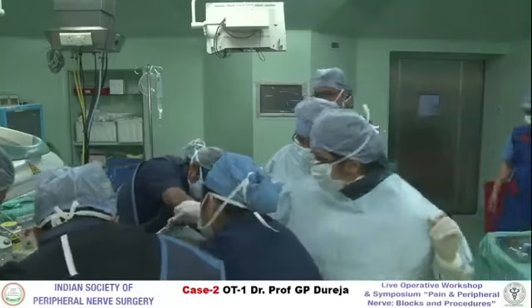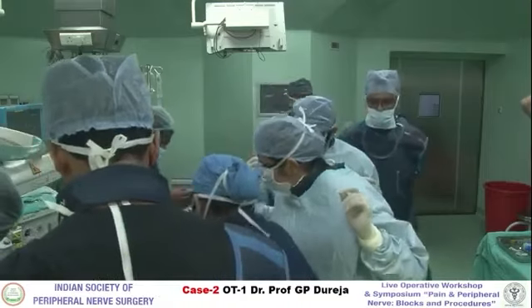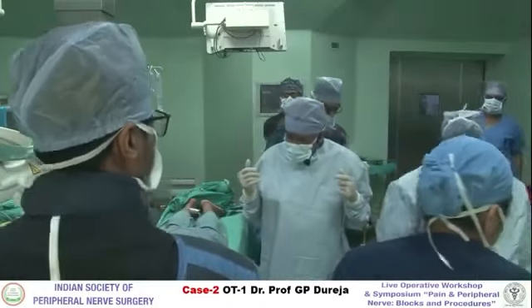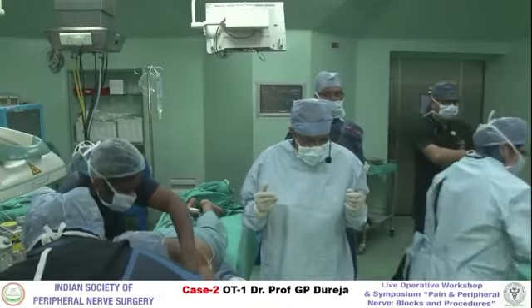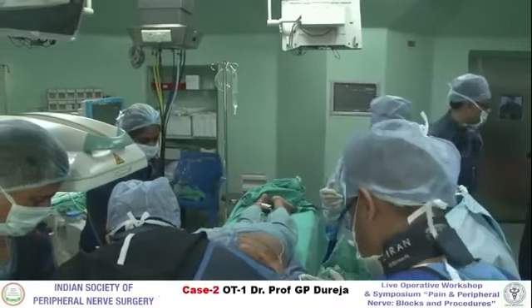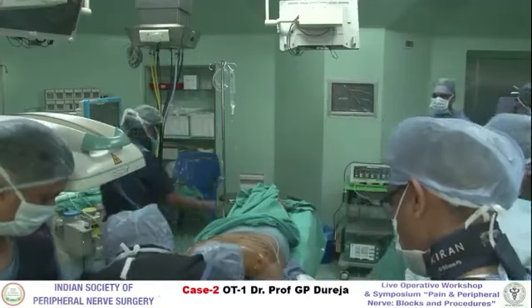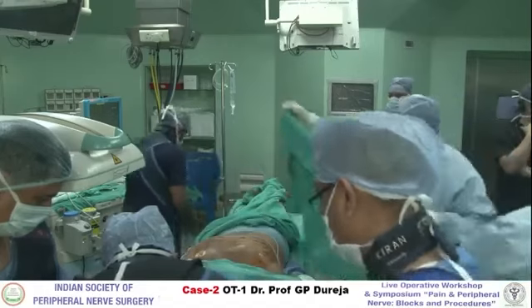What are those cases where you want it to clear as early as possible? Suppose the dye spread is not proper and we want to reposition the needle, then the needle tip will not be visible if the contrast is not diluted. The contrast we have given and the dye spread is not optimal, then you have to reposition the needle to get the spread in a proper way. For that, sometimes the diluted contrast may help. But otherwise, as you perfect the procedure, you may not need to dilute the dye.